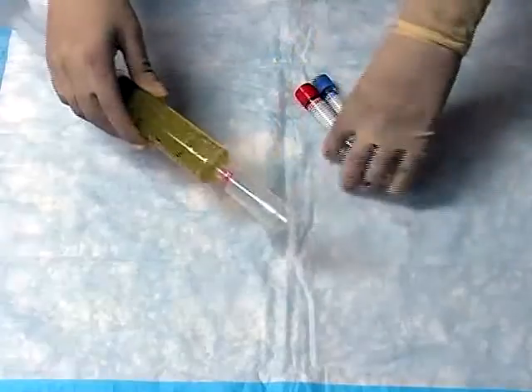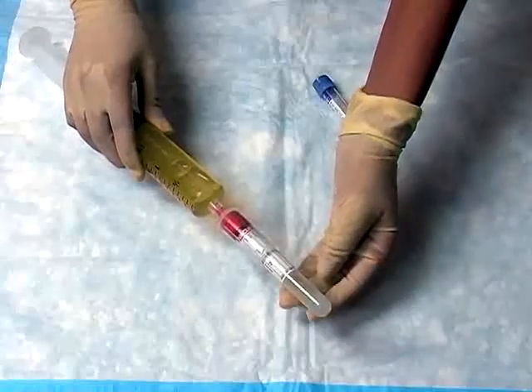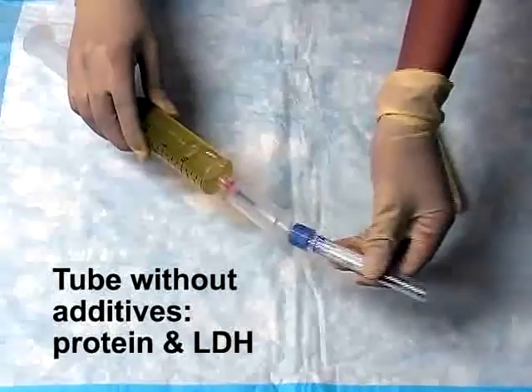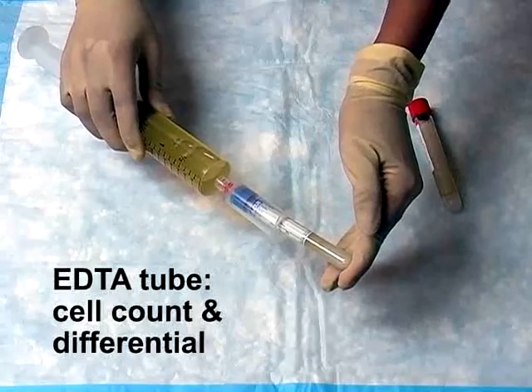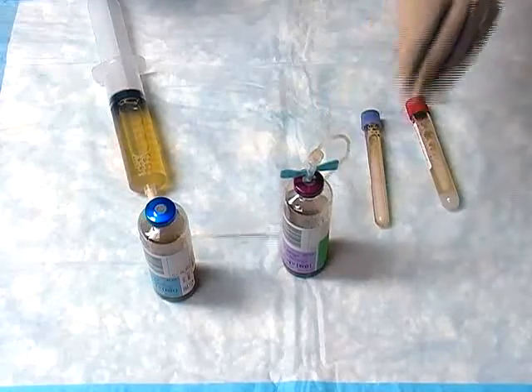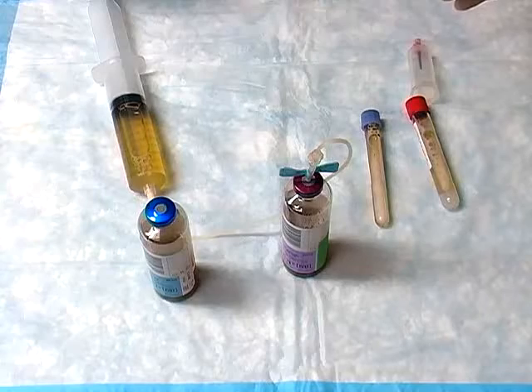Pleural fluid should be promptly transferred to appropriate collection tubes and submitted to the laboratory for analysis. A tube without additives is submitted for LDH and protein analysis, and an EDTA tube is submitted for cell count and differential. Aerobic and anaerobic culture bottles should be inoculated at the bedside if infectious etiologies are of concern.